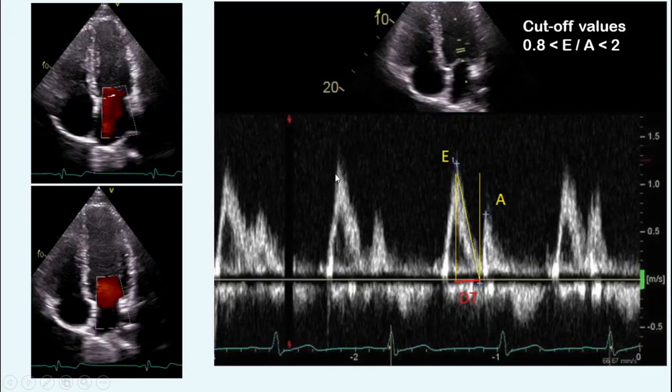With diastole start, the pressure in the left ventricle becomes lower than the left atrium, and the blood suddenly rushes and is sucked into the left ventricle. In that case, since the blood goes toward the transducer, it gives us a positive shift that we call E, and it represents rapid filling or passive filling.